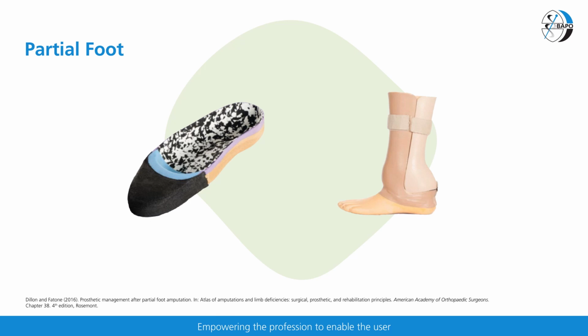Depending on the extent of the amputation, the type of prosthesis prescribed may vary from a toe filler option, such as the image on the left, or one that requires componentry such as a prosthetic foot for the example of a transmetatarsal or Chopart amputation, i.e. the toes and forefoot have been amputated.